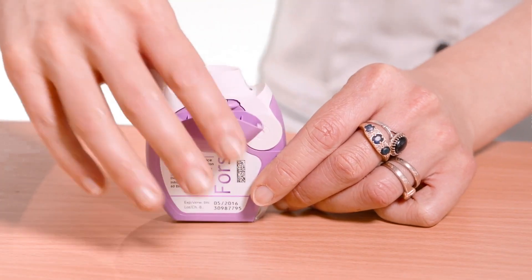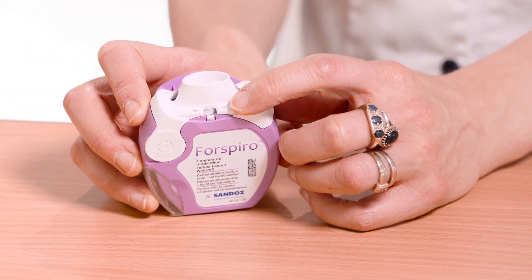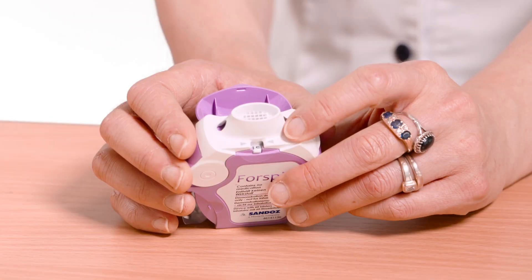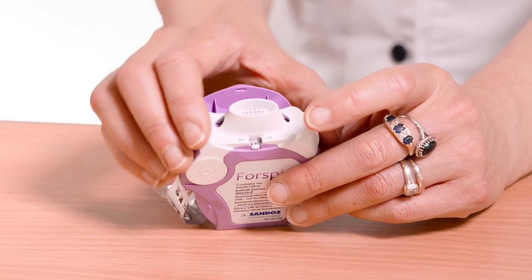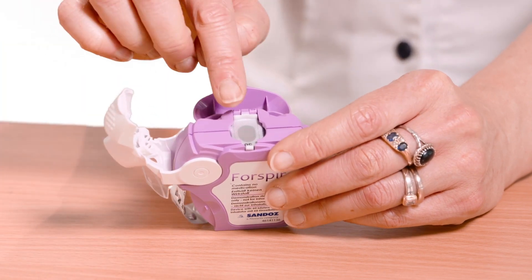Open the protective cap downwards to reveal the mouthpiece. Check the dose counter to establish the number of remaining doses. Move the white lever over fully as far as it will go until it clicks. This action moves the new dose into position.